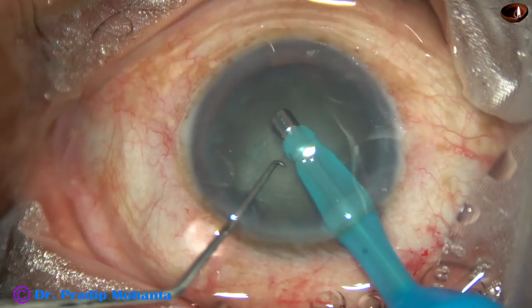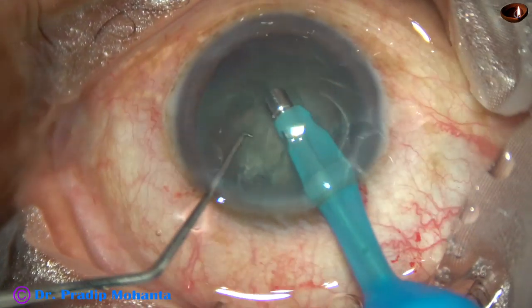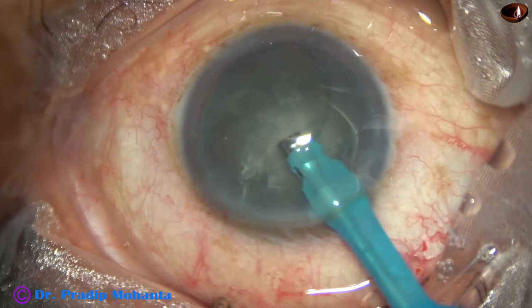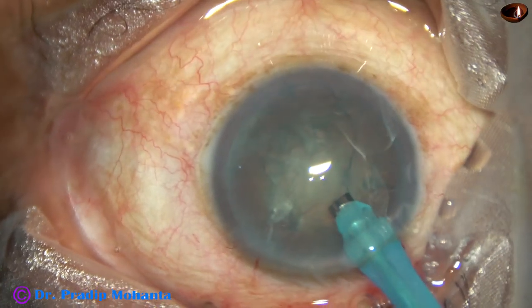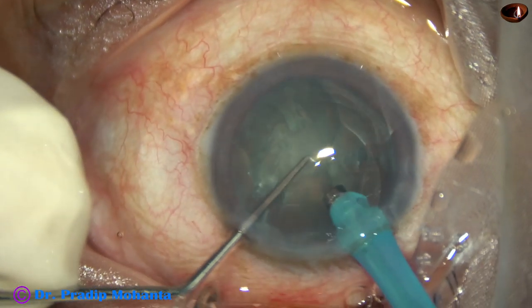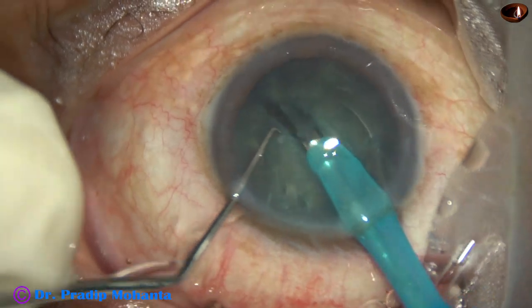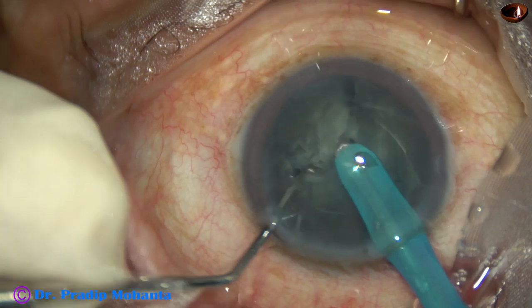Go in. Aspirate some superficial cortical lens matter. And now, just in front of the main incision, bury the tip into the substance of the nucleus. Hold the nucleus firmly at the center. And chop it.